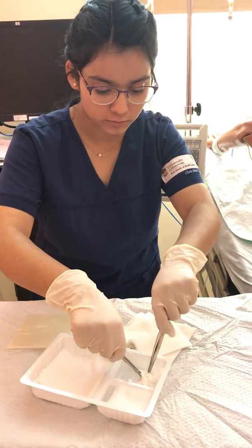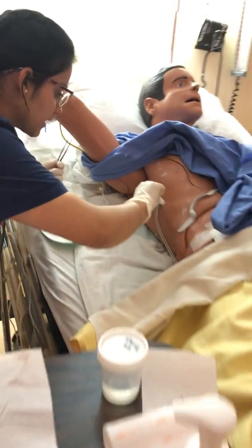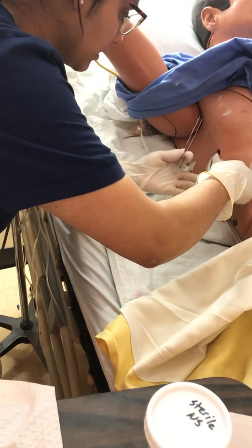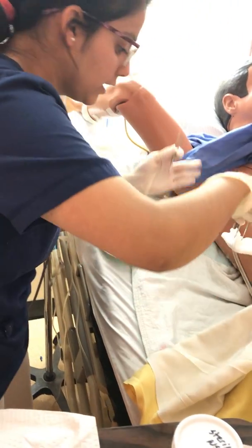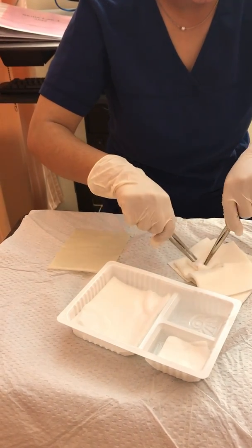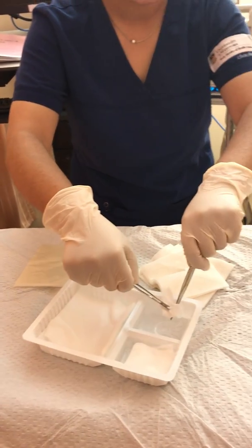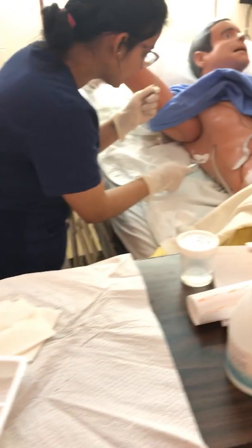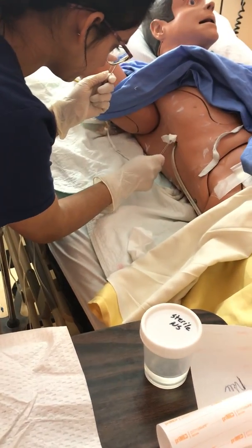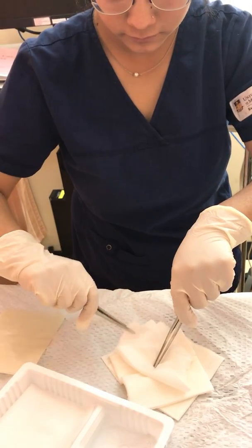And I'm going to dip it in normal saline, get rid of the water. So now we're going to go from the center. I'm going to get my body nurse to go underneath. Make sure I'm holding it. Get me another, and this can be Mefix tapes. My body nurse is going to stay with the patient. I'm going to go get two Mefix tapes. And I'm just going to get rid of the water and just clean the bottom because the big one didn't clean it properly. So we're just going to go underneath. And now I'm going to take another big one. Date and time, one of it.